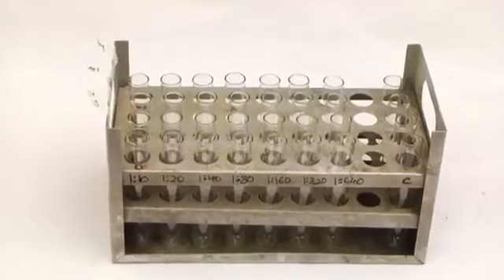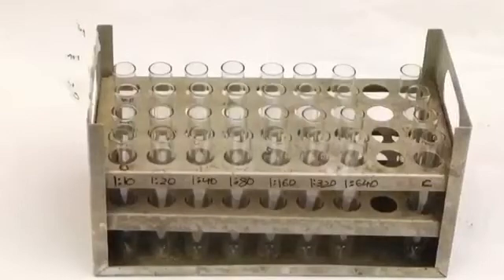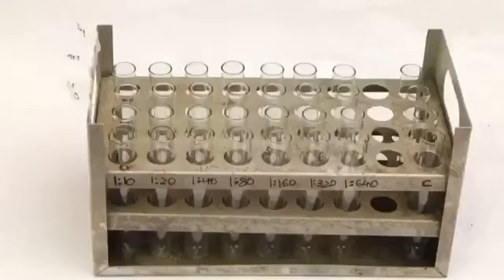Tube method. Take appropriate number of sets, one set for each antigen suspension of eight con tubes or test tubes and label them 1 to 8.